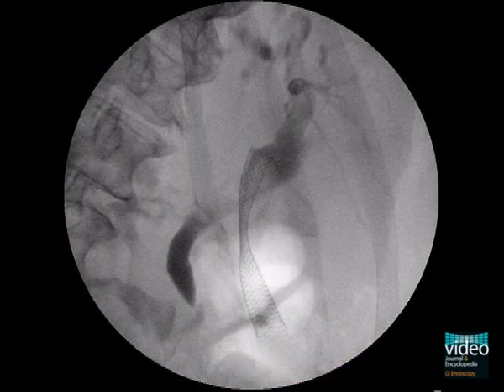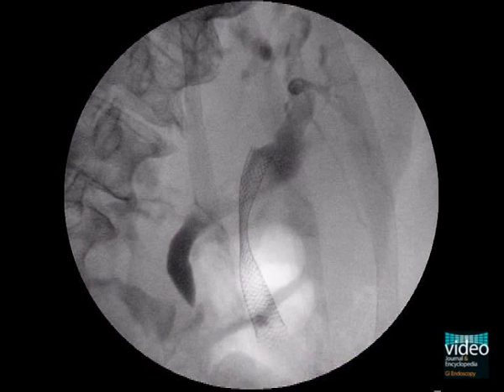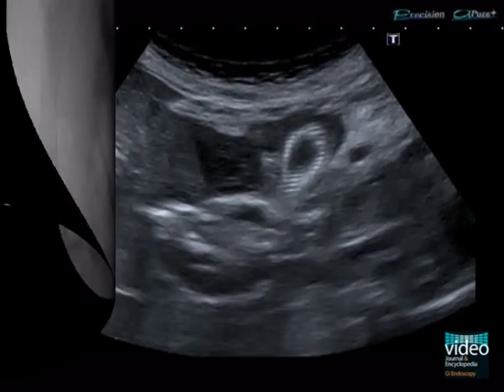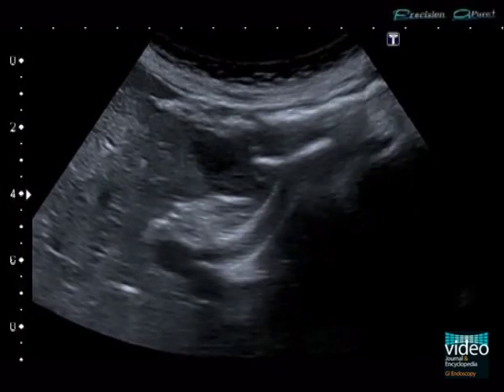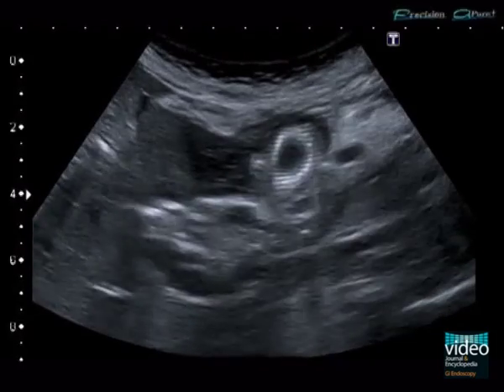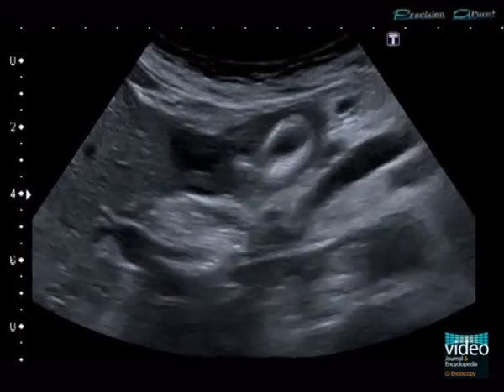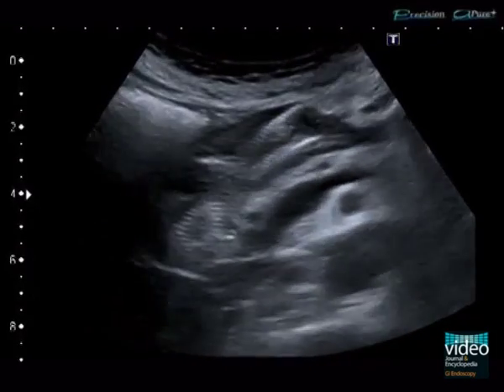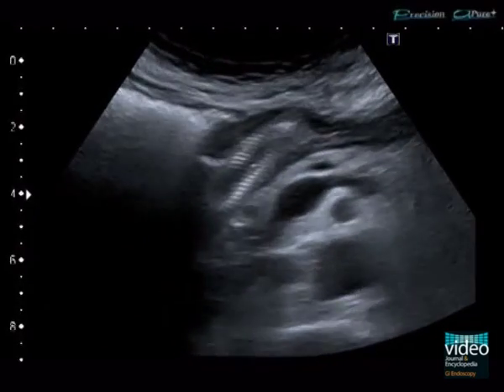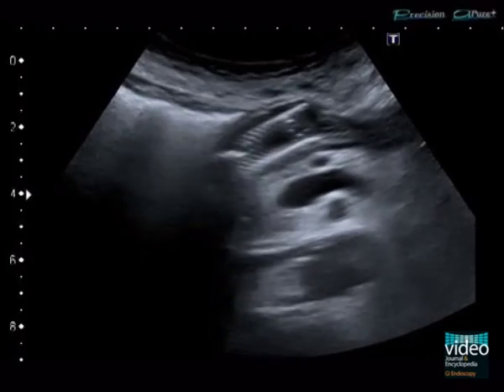The sequences show that the intra-duodenal stent part is directed through the pylorus into the gastric cavity. Further control fluoroscopy shows the correct stent position. In addition, effusion of contrast media into the stomach can be seen.